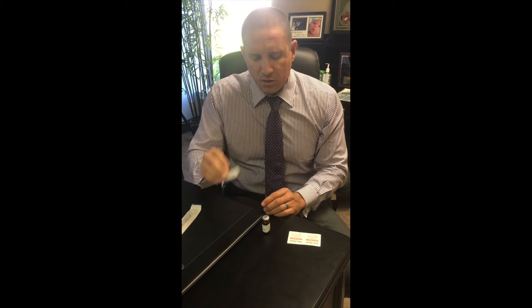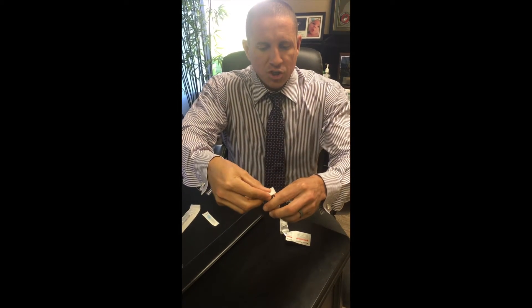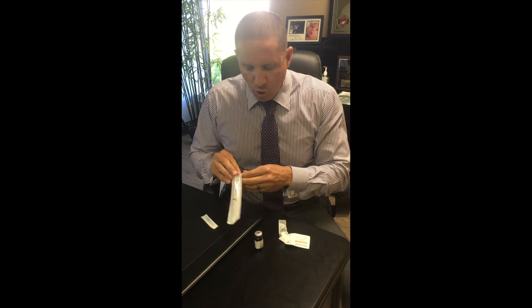What you want to do, as always, is alcohol off the top of the bottle just to sterilize it. Just one swipe is enough, just like this. Then you're going to open up your 3ml syringe.